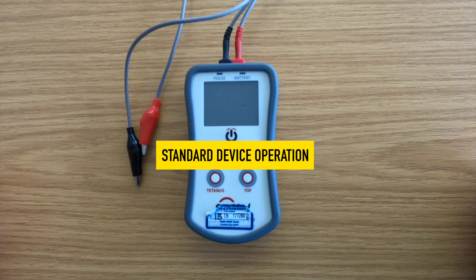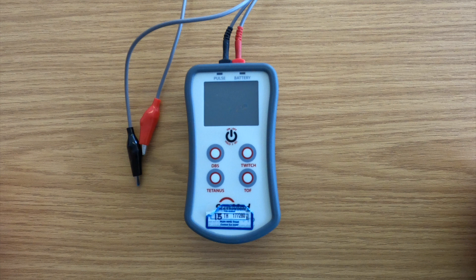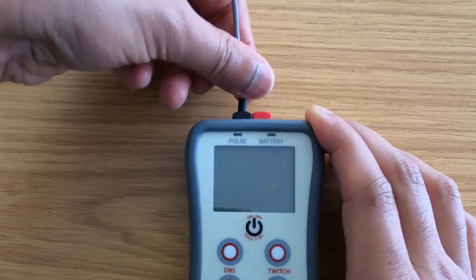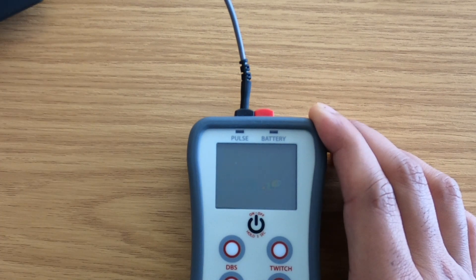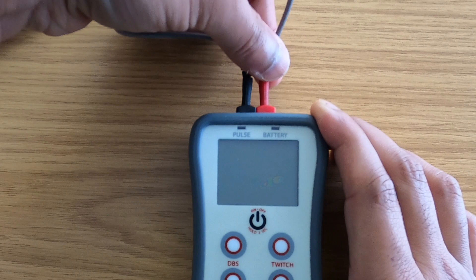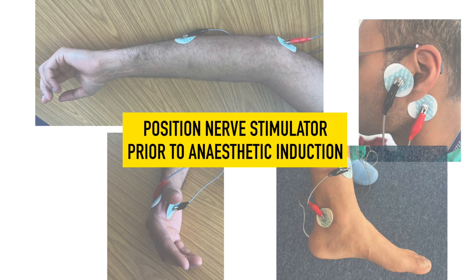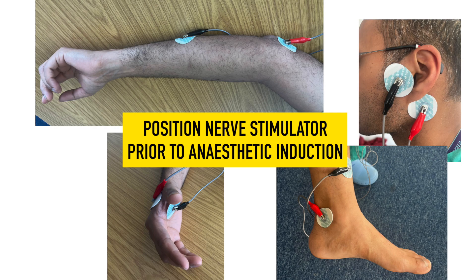Standard device operation. Nerve stimulation can be carried out using surface electrodes. Connect the lead wire with the black plug to the black or negative output connector, and the lead wire with the red plug to the red or positive output connector. The nerve stimulator should be positioned over the selected nerve prior to anaesthesia induction.